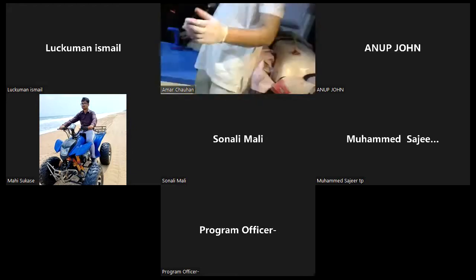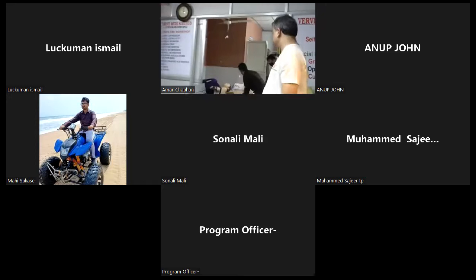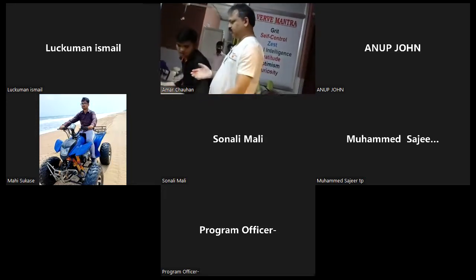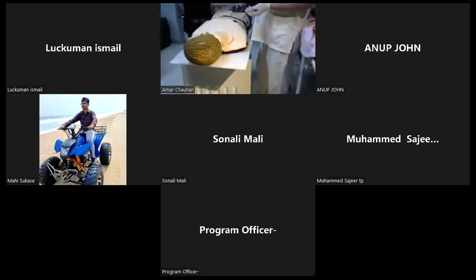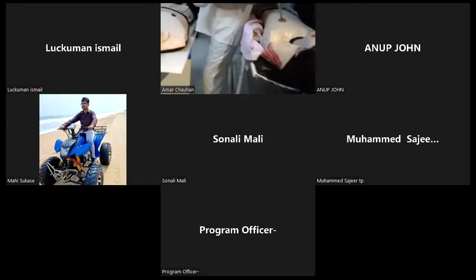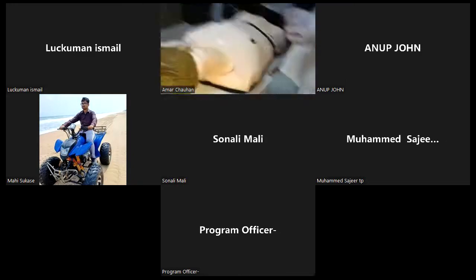The next skill will be central line. So central line is not in the coated products. Okay, what else is left then? But if they want to see, I can show them. Yes, sir, yes, sir. Ask them. Just show that if possible.